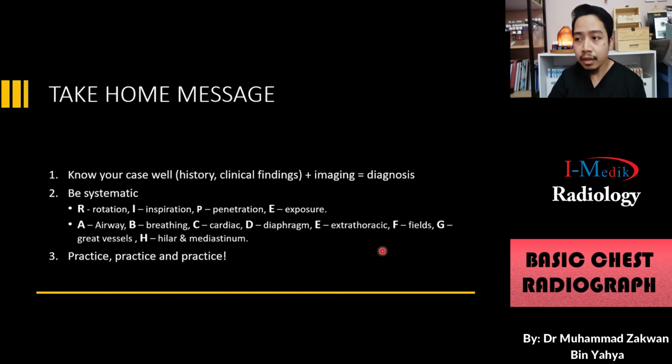That's why for us in radiology, the quality of a certain study is very important, because if the study is suboptimal, we couldn't assess that area in the chest radiograph properly. We might get a false positive. We might find a false negative. So it's very difficult with a suboptimal study, so we need to assess it properly.